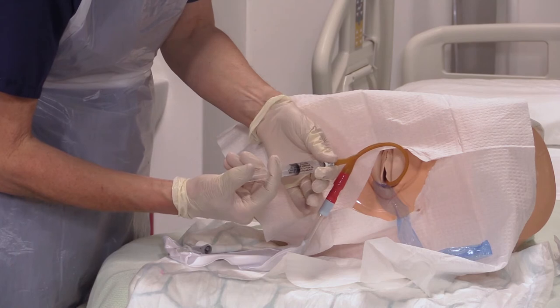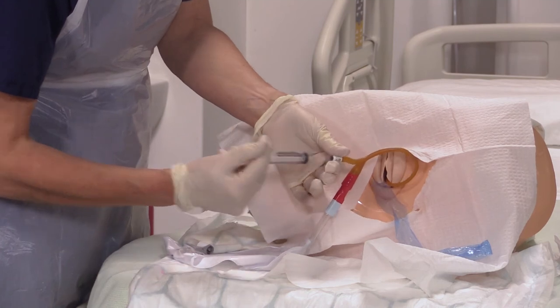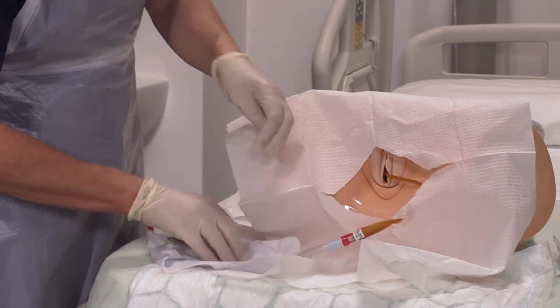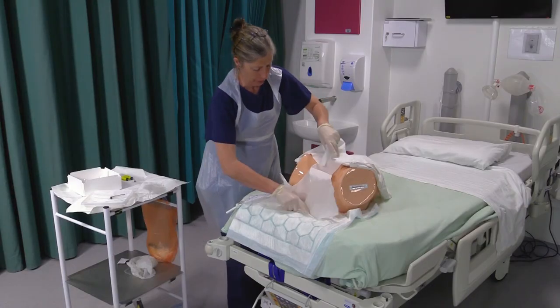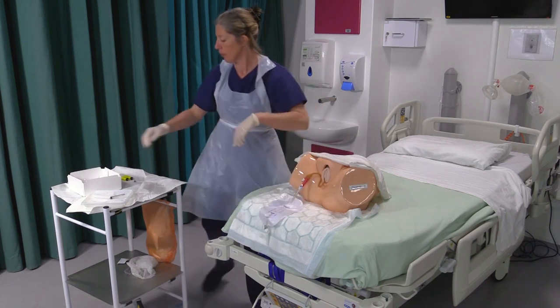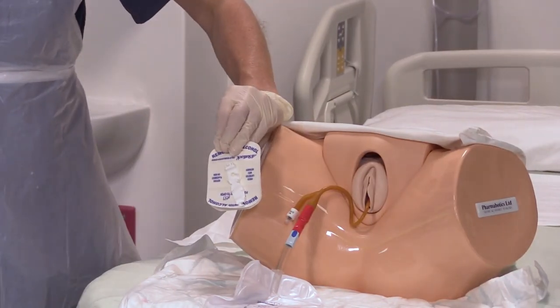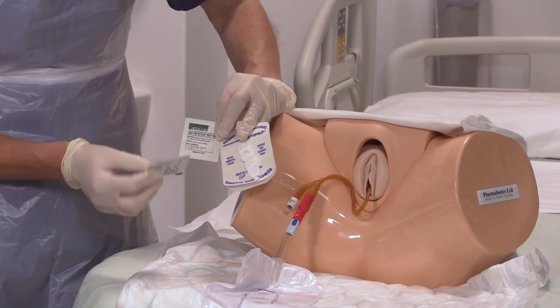Once the balloon has been successfully inflated into the bladder, gently pull the catheter out until you meet some resistance. This allows you to check that the balloon is inflated in the bladder and is now in the correct position. Your catheter pack may come with a connecting device that will secure the catheter to the patient's leg, or your catheter may go onto a catheter stand or secure to the patient's leg, minimising patient's discomfort.